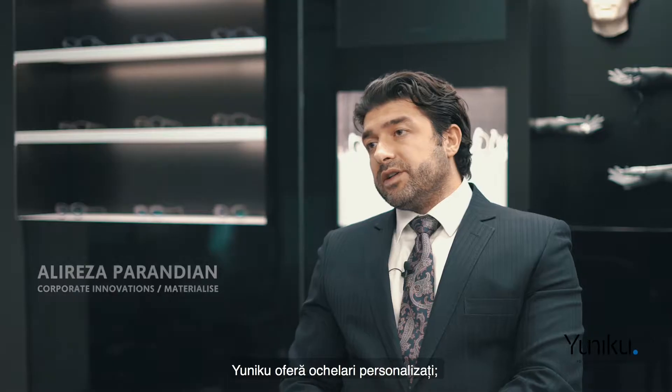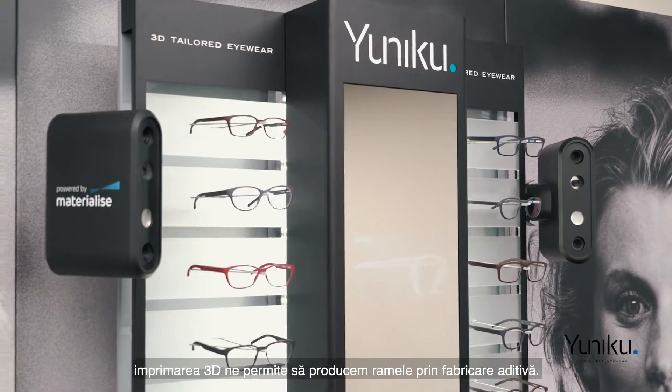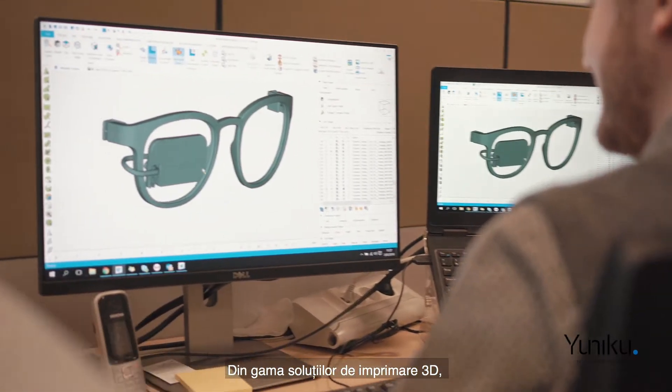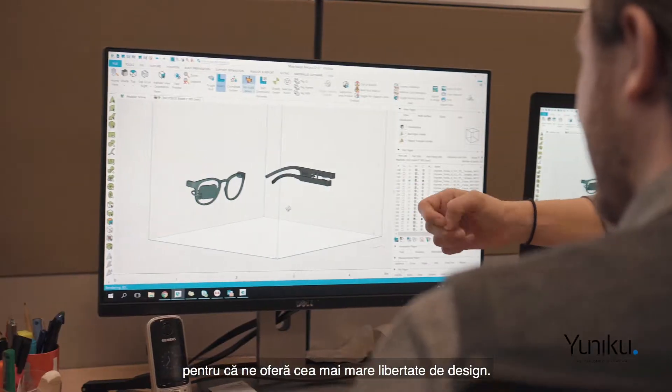Yuniku offers eye care professionals the ability to offer made-to-measure eyewear. 3D printing allows us to build a frame in an additive way. We're using laser sintering technology within the spectrum of 3D printing approaches because it allows us the highest degree of freedom of design.